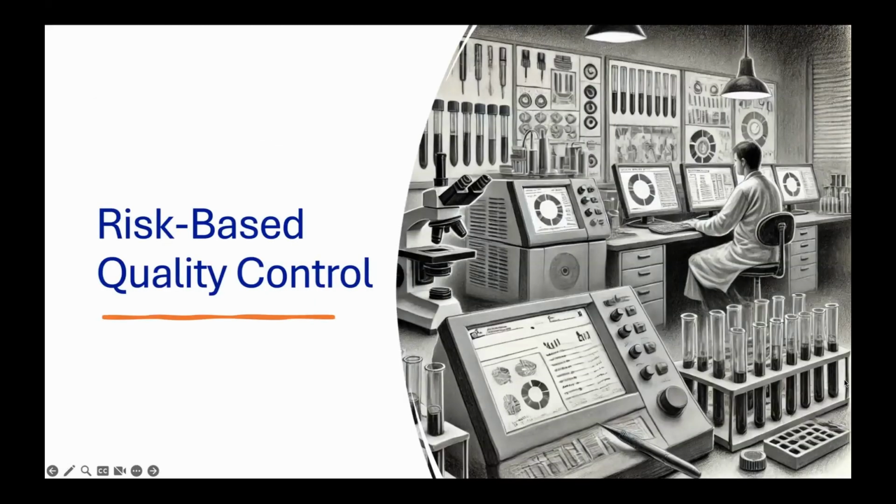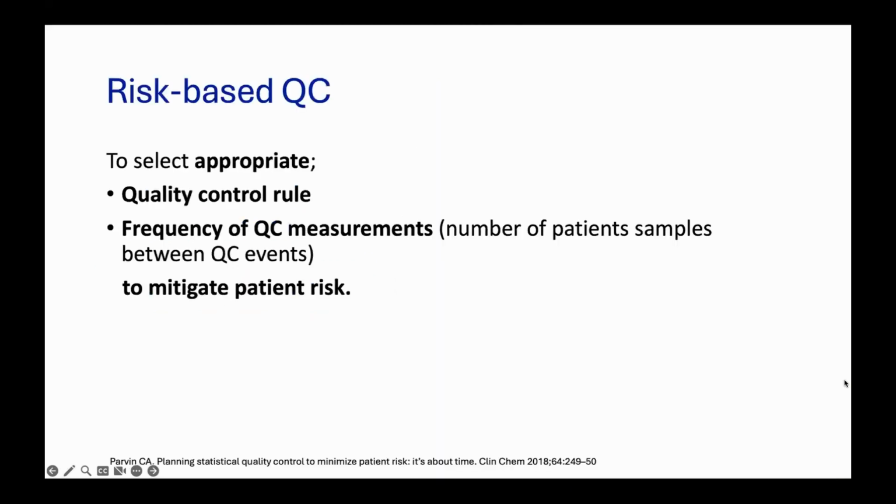Now we have a fundamental understanding of quality control. Let's proceed to risk-based quality control. The goal of risk-based QC is to select an appropriate quality control rule and frequency of quality control measurements to mitigate patient risks.